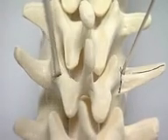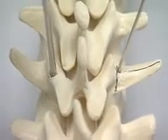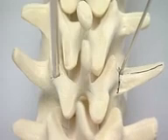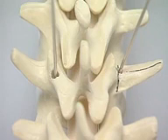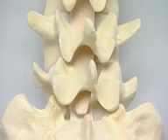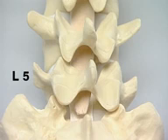The pedicle probe is now used to drill through to the anterior cortex. A K-wire is inserted. It can be seen that there is less angulation towards the midline with the medial entry point. This sequence is repeated for the L5 vertebra.